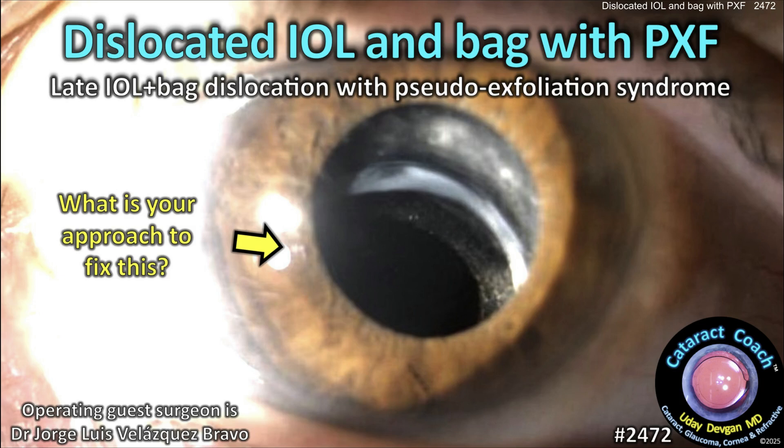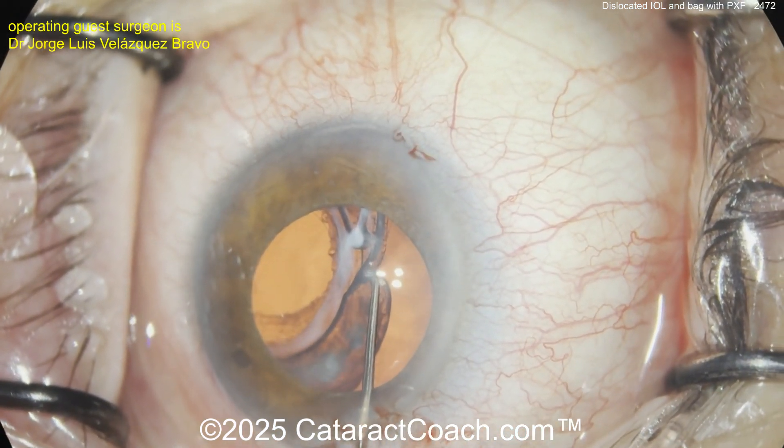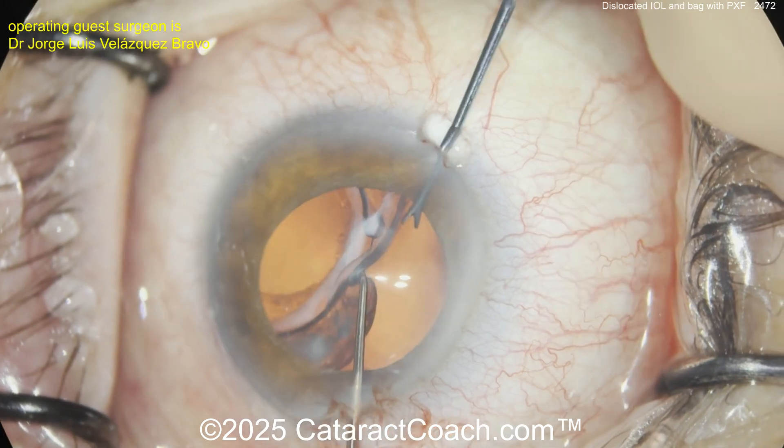cataractcoach.com — dislocated IOL and bag with pseudoexfoliation. This is late bag and IOL dislocation because of progressive pseudoexfoliation. Look at this: there is no zonular support left. You can see that the fibrosed capsular bag is wrapped around the IOL.